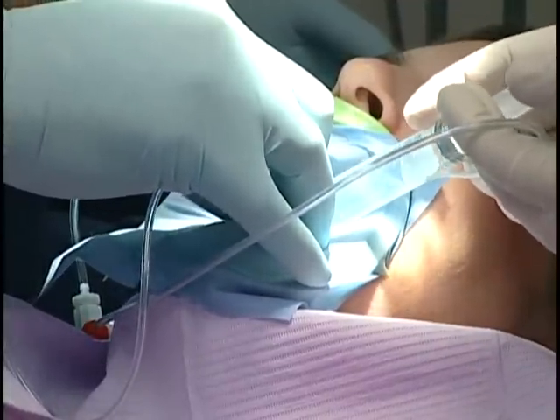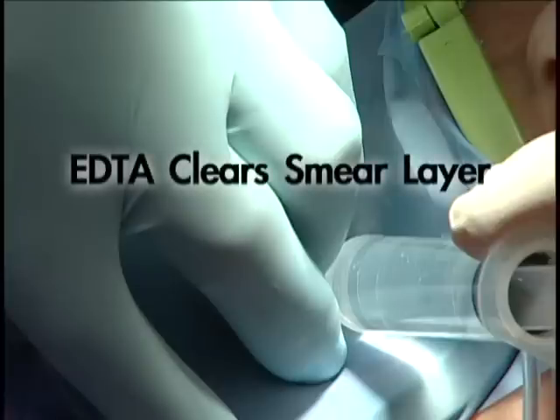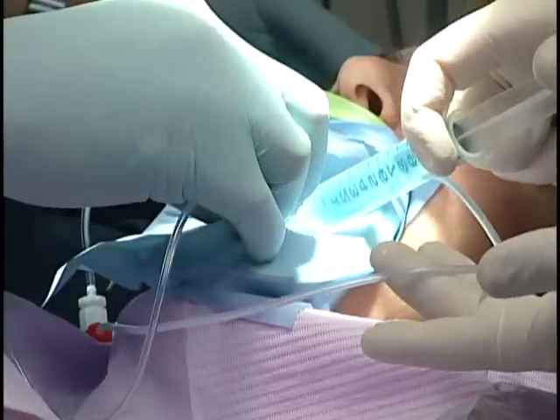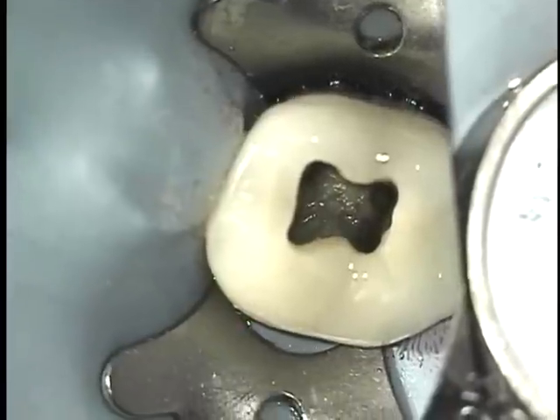Once I've done all of the canals, I'll repeat this process using liquid EDTA. This clears the smear layer. Then I'll repeat the process using sodium hypochlorite to penetrate the dentinal tubules, followed by a final round with chlorhexidine. The result is second to none debris removal and bacterial hydrolysis. Let's take a look through the microscope.